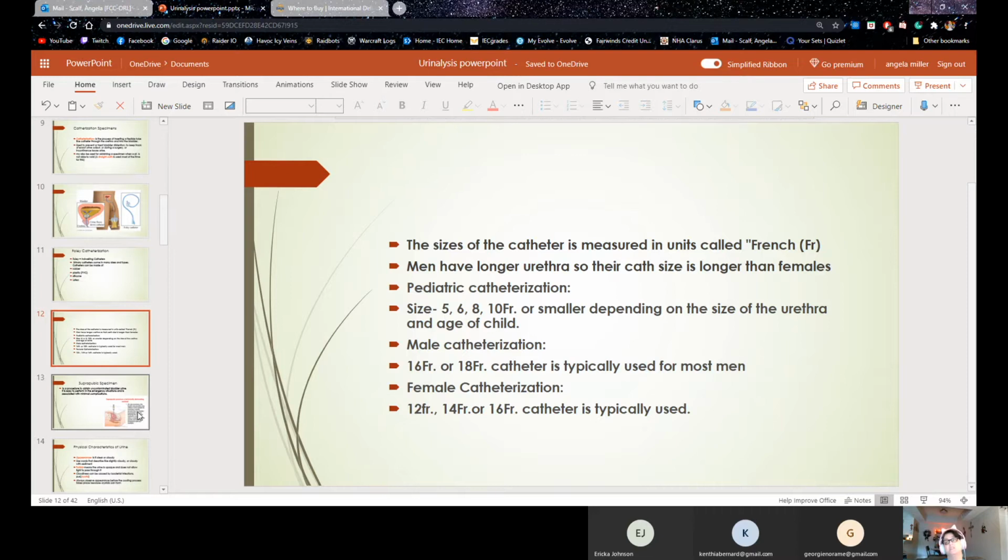If you're ever assisting a doctor and he says, hand me a 7 French. You're like, 7 French? What are you talking about? Basically that means he wants a 7 diameter Foley catheter. Because Foleys are measured, their diameter is called French, and it's abbreviated like here on the PowerPoint, FR.